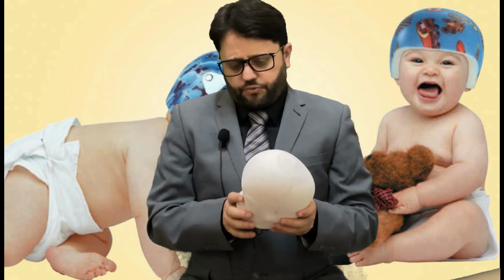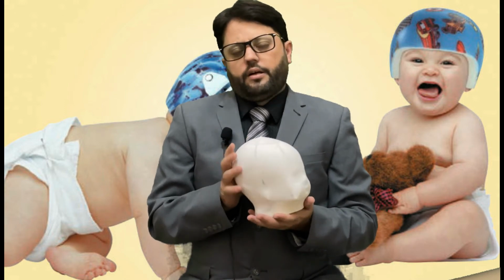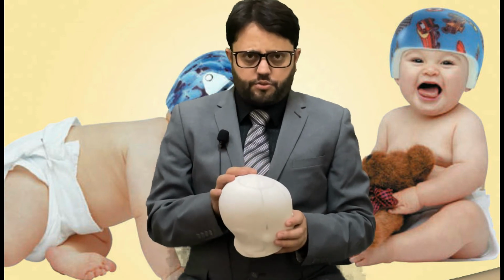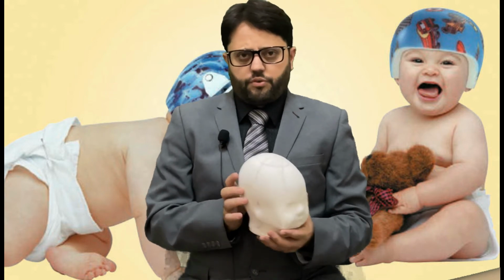The fourth form of head problem for cranial remolding orthosis or helmets is the post-operative case after craniosynostosis. If the patient is diagnosed with craniosynostosis, the neurosurgeon will go for surgery.